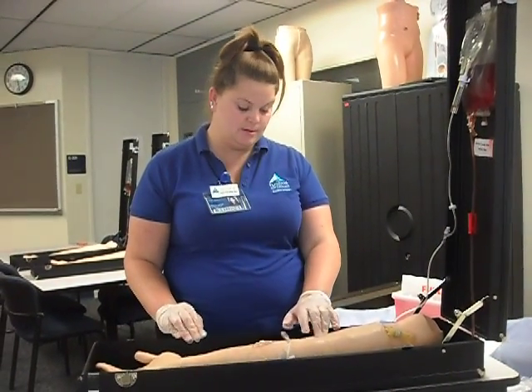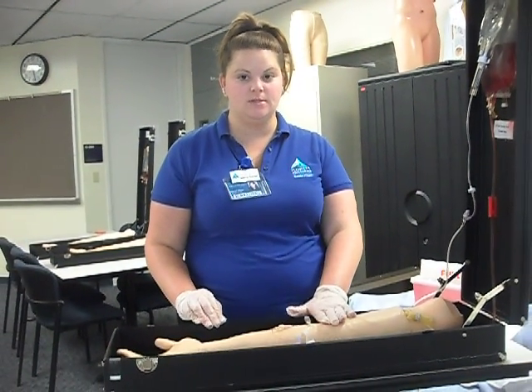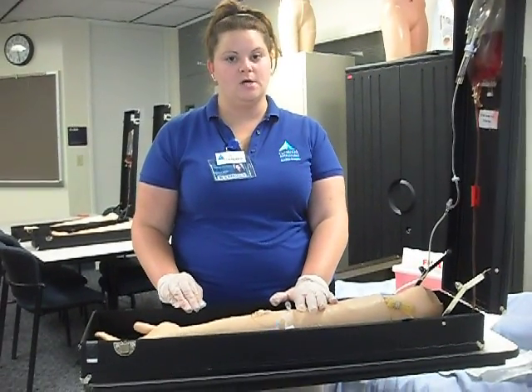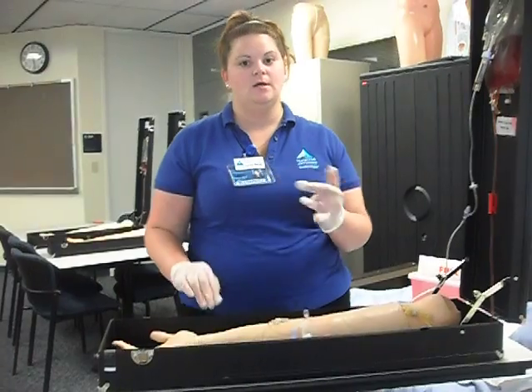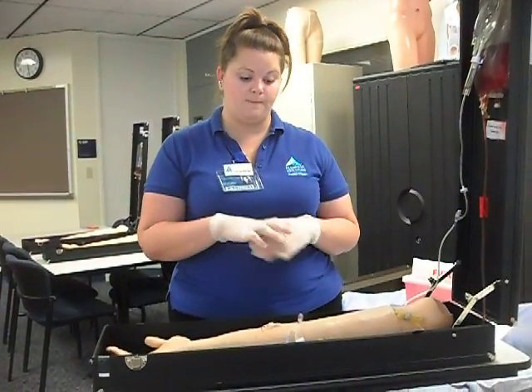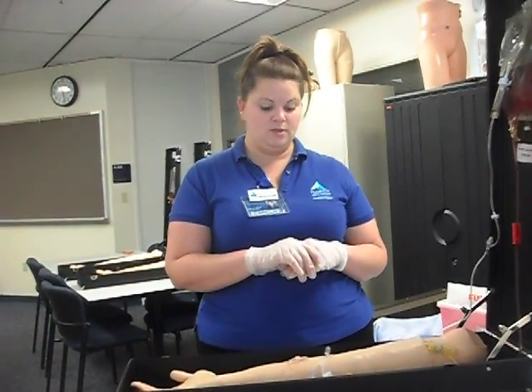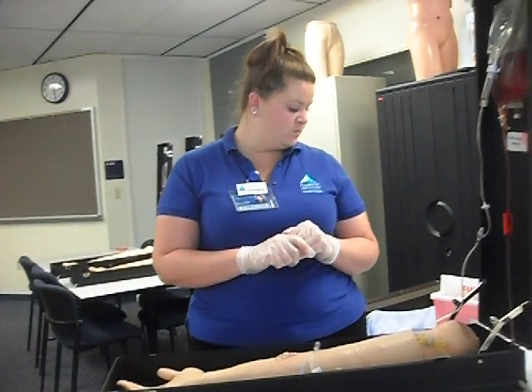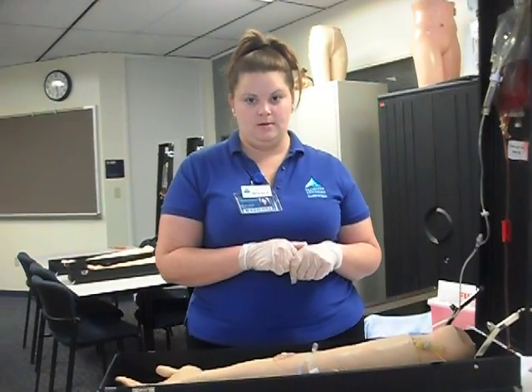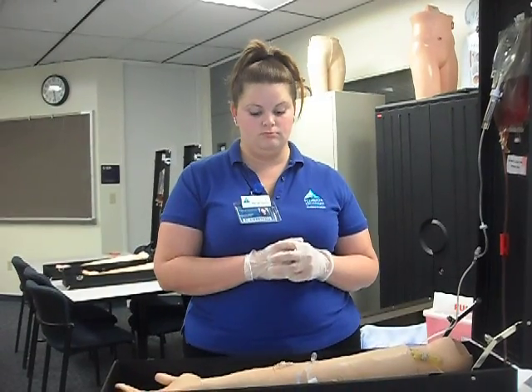And I'm going to monitor the site periodically. And when I leave, I am going to document. I'm going to document the date, the time, the medication, the route, the dose, the site, record the volumes and the meds and the condition and the ins and outs. And that's it, I think.